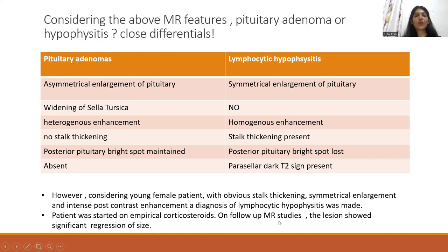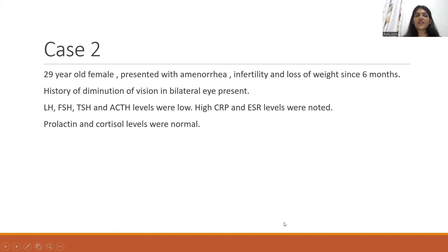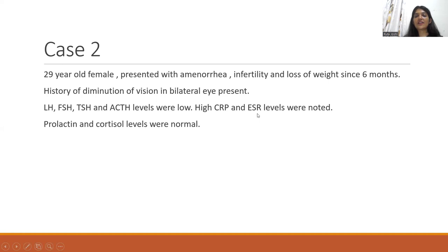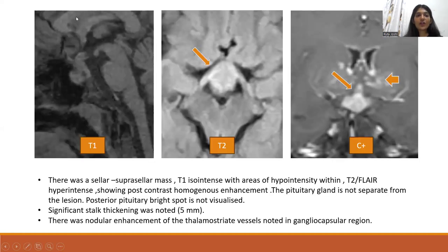The patient was started on steroids, and on follow-up MRI showed regression. Case 2 is a 29-year-old female presenting with amenorrhea, infertility, and loss of weight since 6 months. History of diminution of vision in bilateral eyes is present. Anterior pituitary hormones are low. High CRP and ESR levels are noted. Prolactin and cortisol are normal. On T2 and T1 weighted images, there is a sellar mass with a hypo-intense nodule within, T2 hyper-intense, showing homogeneous enhancement with stalk thickening of approximately 5 mm on post-contrast.